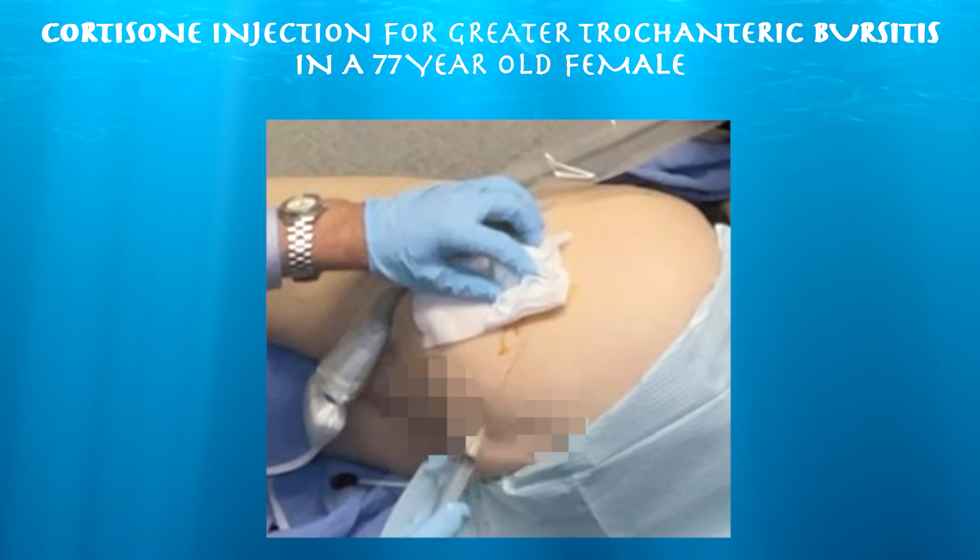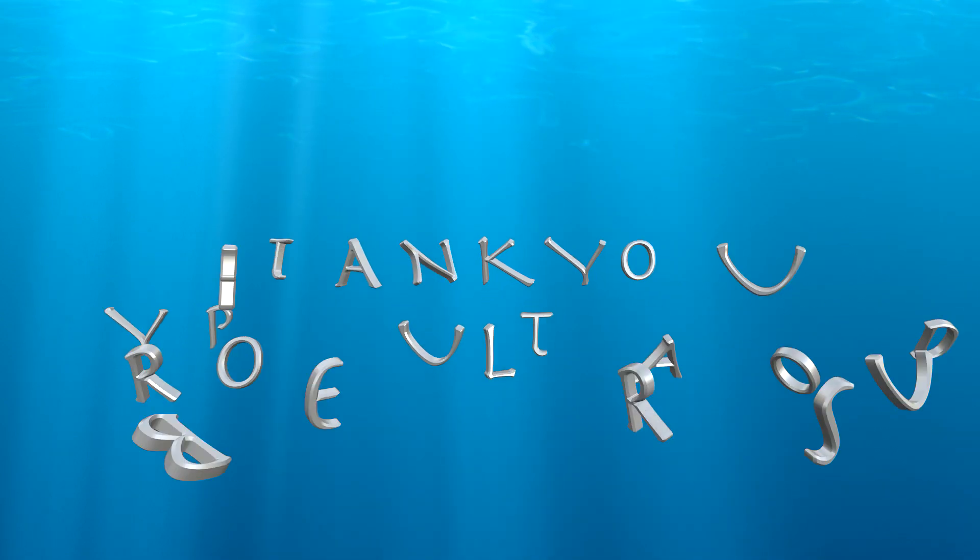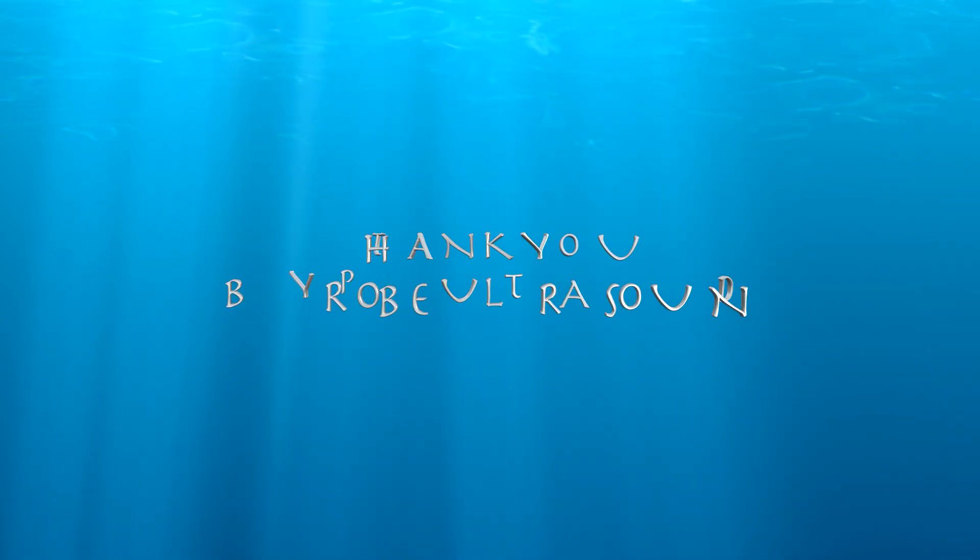You can see the needle coming out — it's a 3½-inch 20-gauge spinal needle. We can see the material being deposited and the needle coming out.